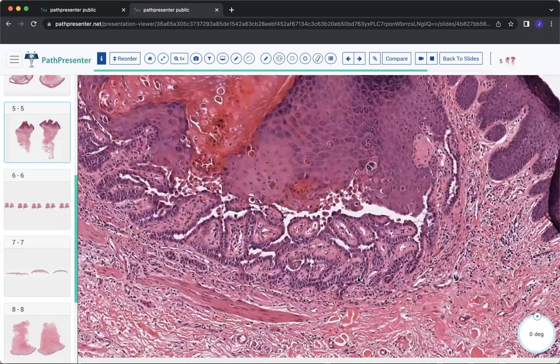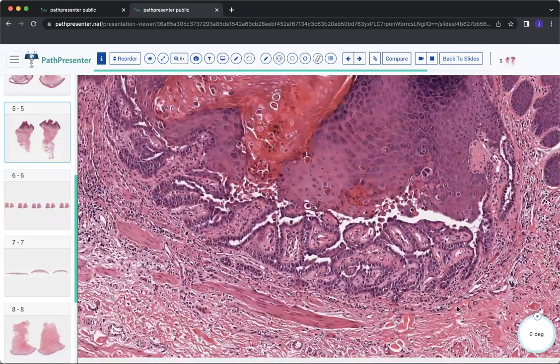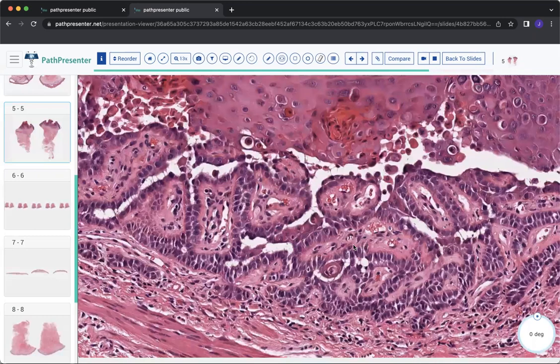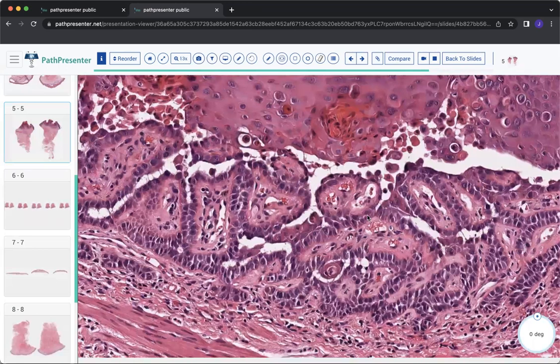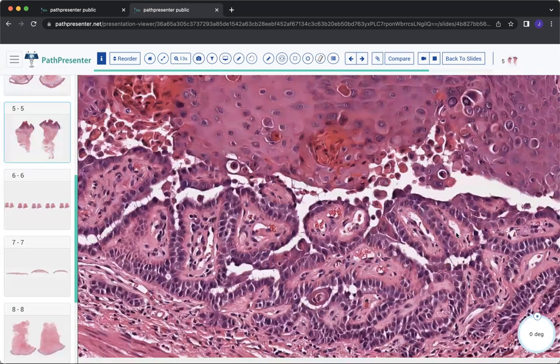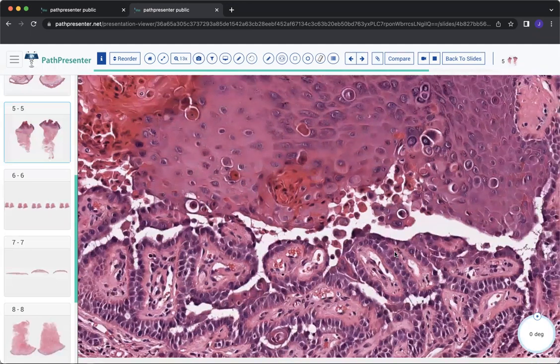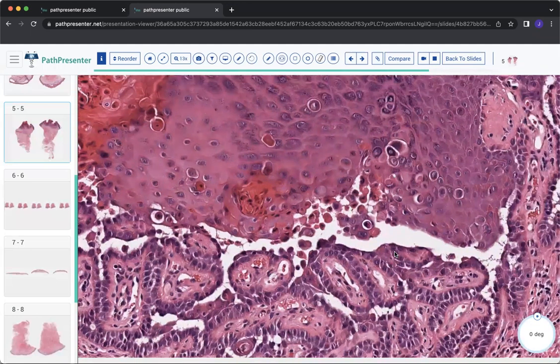So just know the pattern of acantholytic dyskeratosis to give you a proper differential diagnosis. You can also have acantholytic dyskeratosis in Grover's disease, or transient acantholytic dermatosis. It can be more of a Hailey-Hailey appearing variant or more of a Darier appearing variant, but typically these are really small papules.